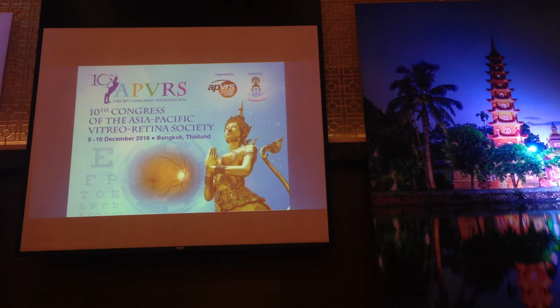But the important thing you should know about the OCT is the axial resolution and the transverse resolution. If you want to buy an OCT machine, the axial resolution is the property you should look at. A smaller axial resolution, like 2 or 3 microns, gives you better image quality compared to a 10 micron axial resolution that you find in the time domain OCT.